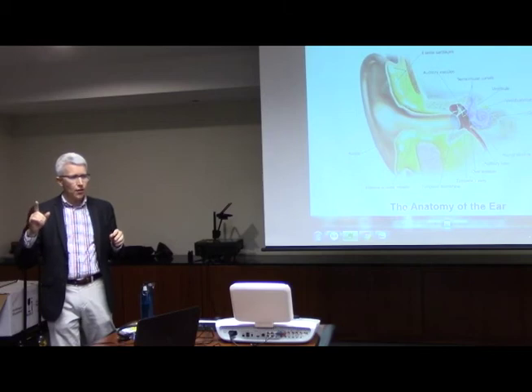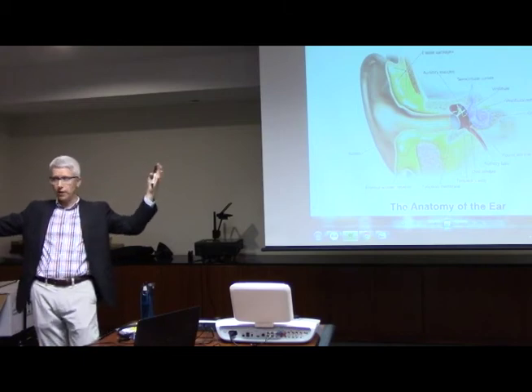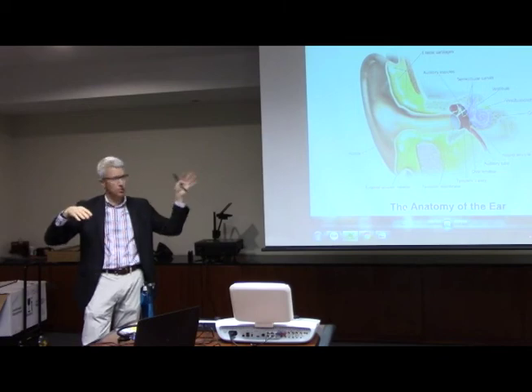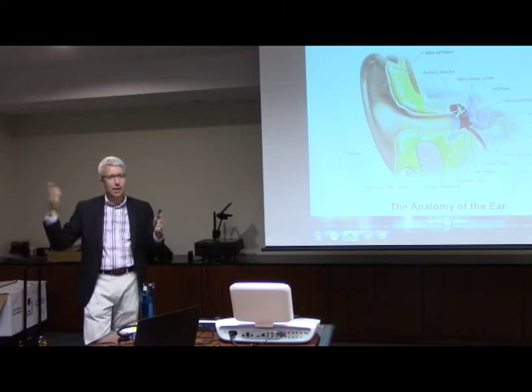With this, I mentioned the VRA, the visual reinforcement toys, which we also have. There are animated toys that light up, and I'll show you this in a second. There are some video monitors that show different things and make different sounds that keep the kids' attention.